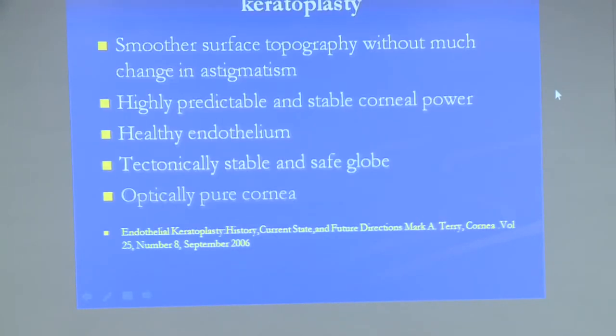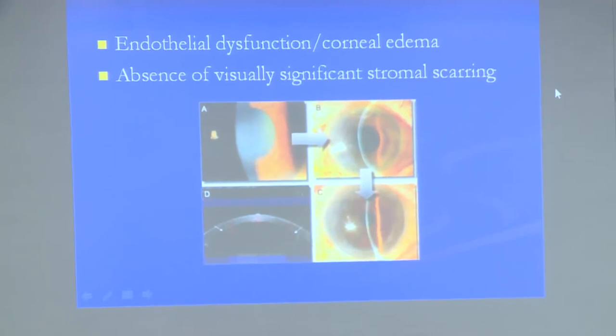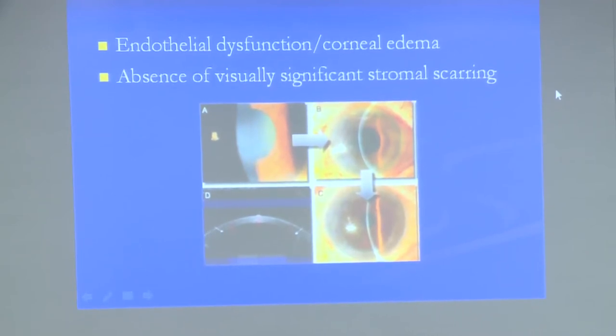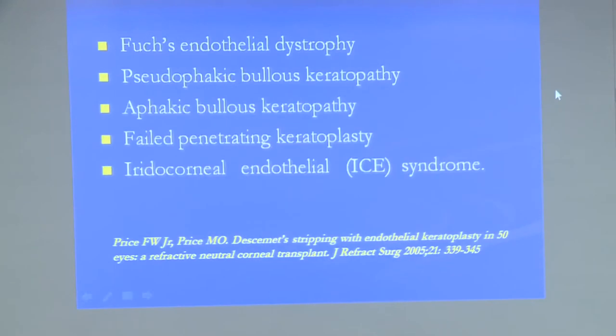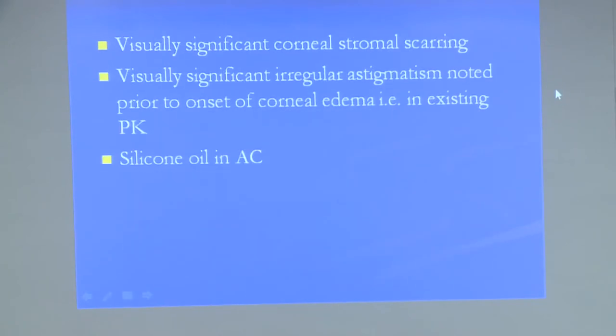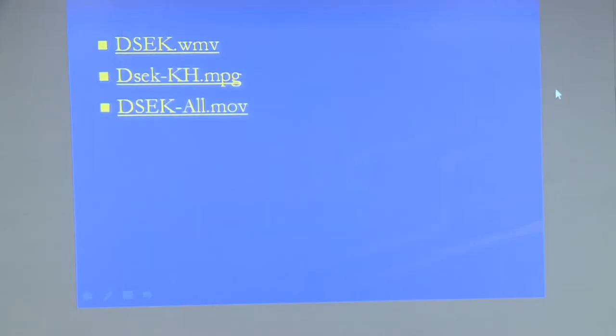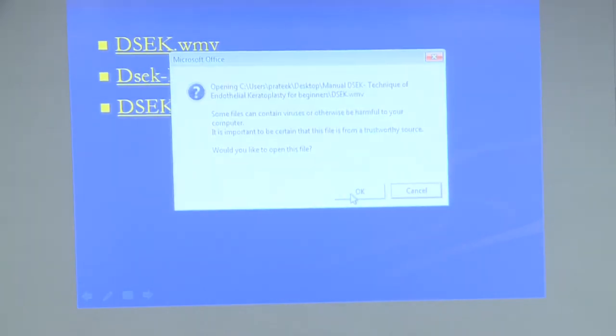I will be speaking today on DSEK. The indications are endothelial dysfunction and corneal edema, and absence of visually significant stromal scarring. Conditions such as Fuchs endothelial dystrophy, pseudophakic bullous keratopathy, aphakic bullous keratopathy, failed penetrating keratoplasty, and iridocorneal endothelial syndrome are the indications. The advantages were taken care of by the previous speakers, so I will just show you my case and how I do manual DSEK.